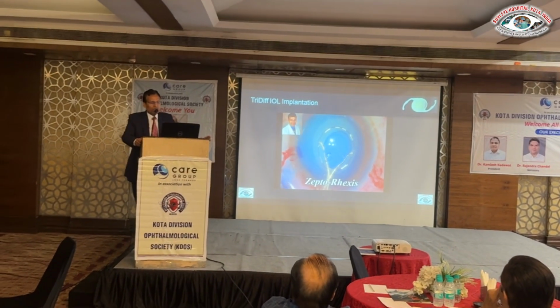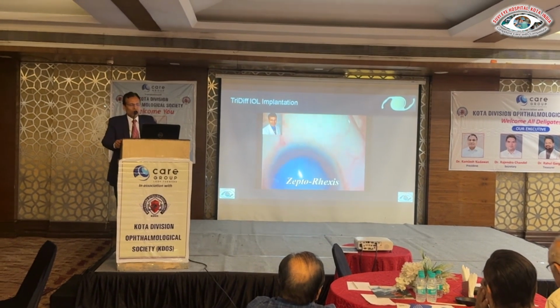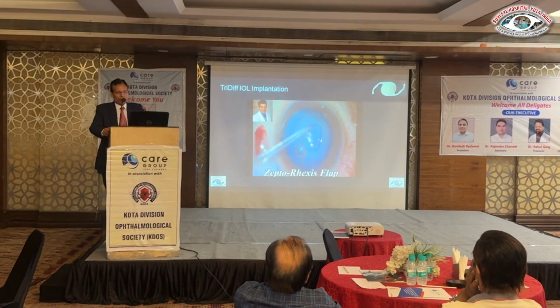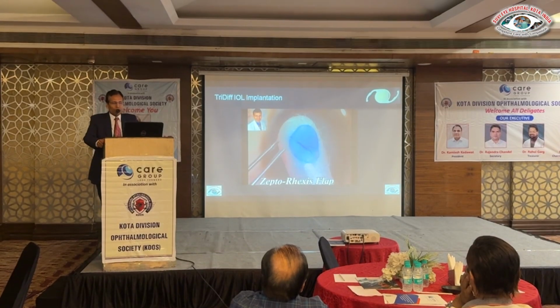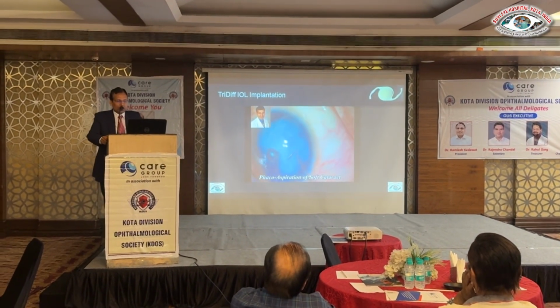So you can see this is a perfect capsulorhexis, no ragged margin, no tags, and this is the capsulorhexis opening. You can see the capsular flap, perfect 5.25 mm size of rhexis. And once you perform the capsulorhexis, then the surgery is not difficult.